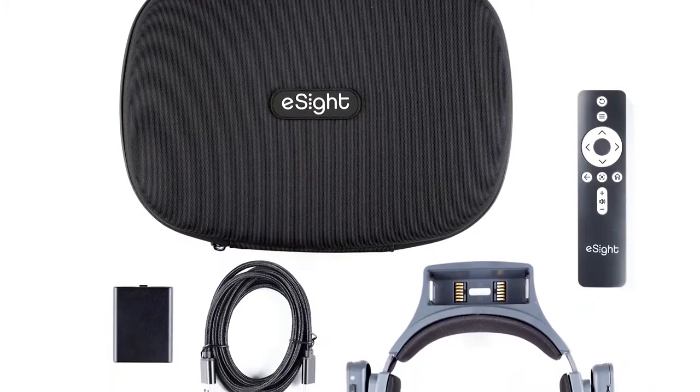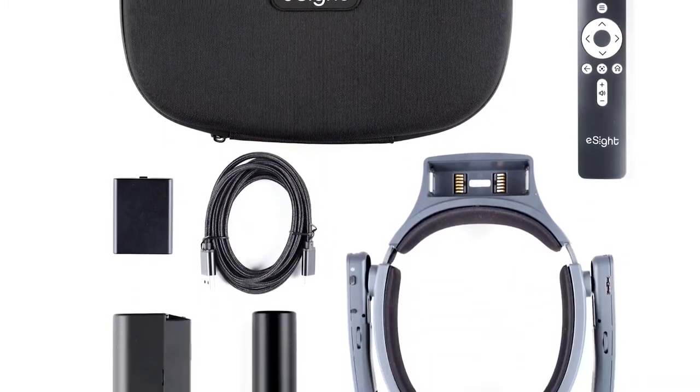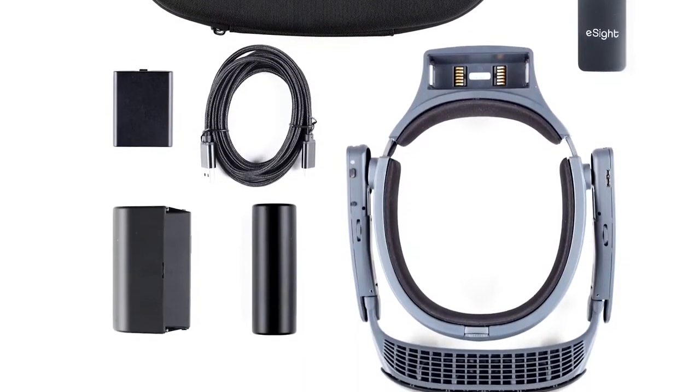In a class of its own, eSight combines leading-edge proprietary hardware and software to not only enhance sight but improve quality of life. Let's start with the proprietary hardware.